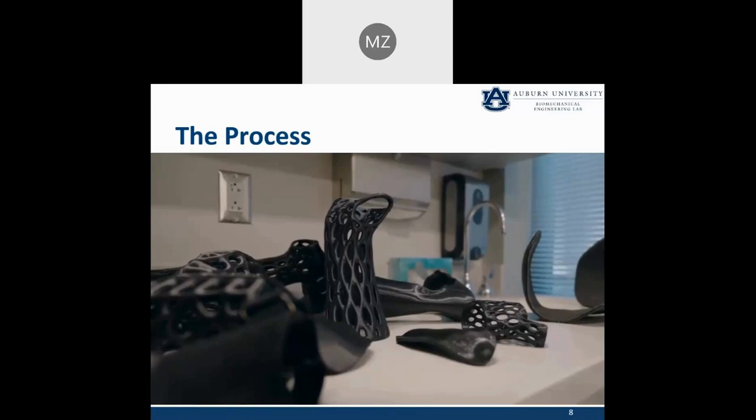One of the major technological developments that we've been able to do via work in the lab is to speed up these prints. A typical hand cast or wrist cast now takes well under 1 hour to 3D print. So you can imagine now that this process has become extremely streamlined, and the utility is very wide reaching at this point.